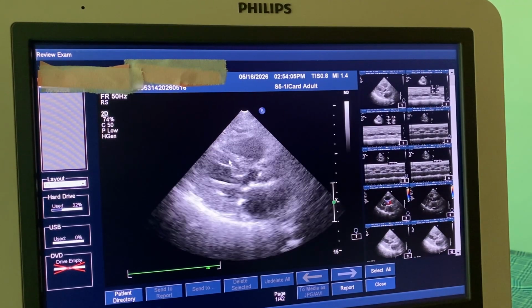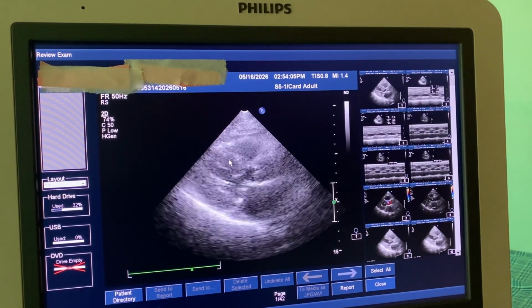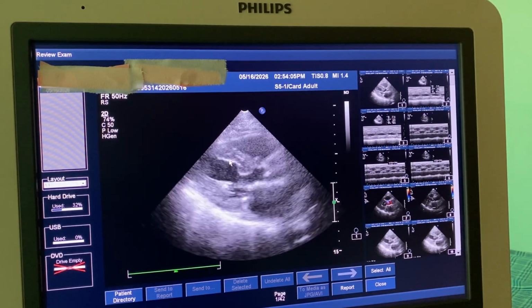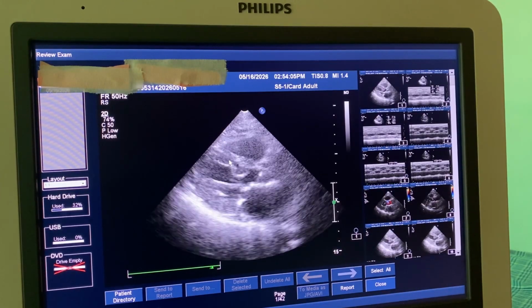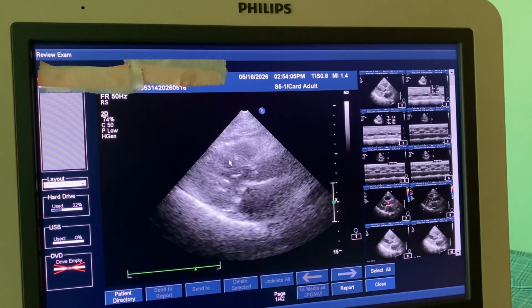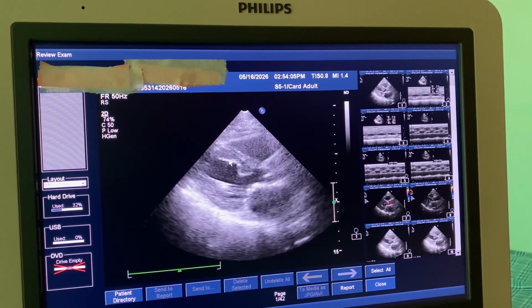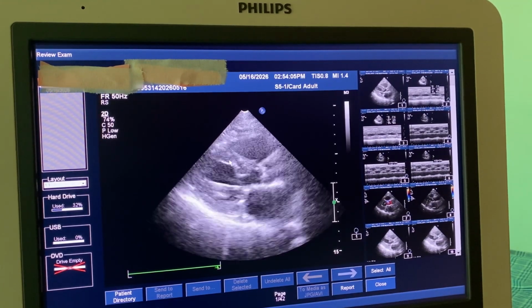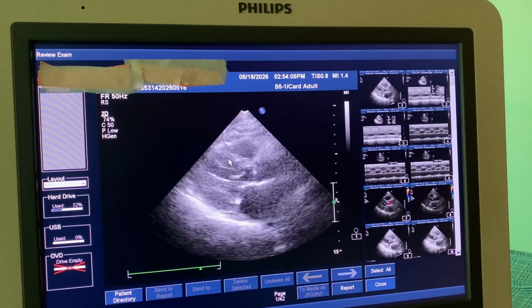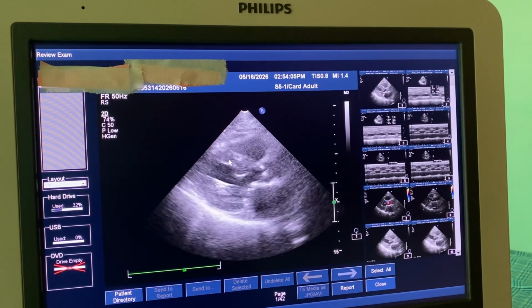So this is a parasternal long axis view. Before we learn how to assess aortic stenosis and grade its severity, assessing and grading, because assessing itself is not much, but grading is the most important thing. The patient has those symptoms, you have to correlate: was it because of hypertension or because of aortic stenosis? Next we see if there is hypertrophy, and regurgitation as usual.